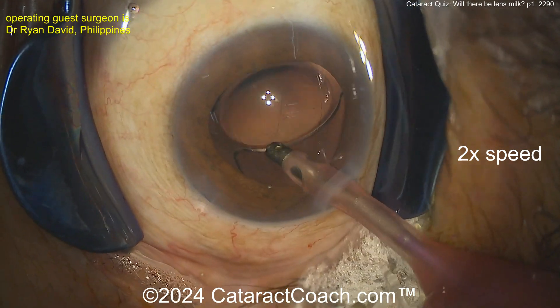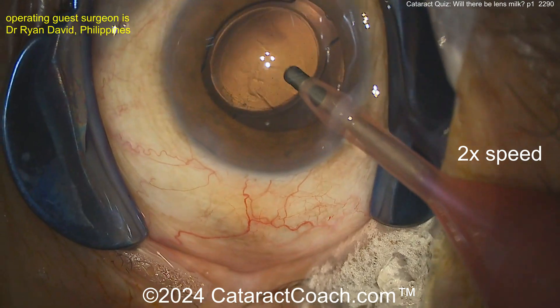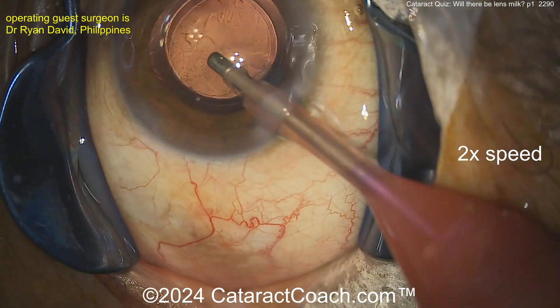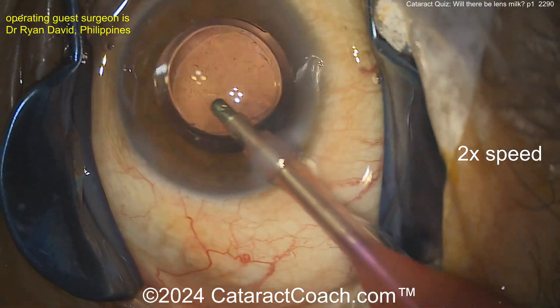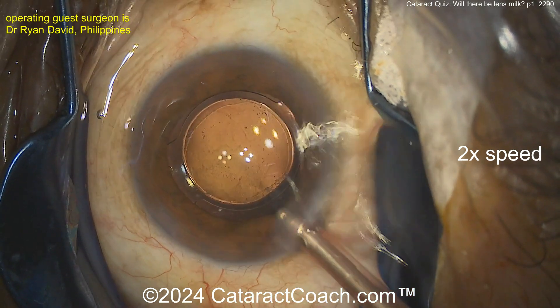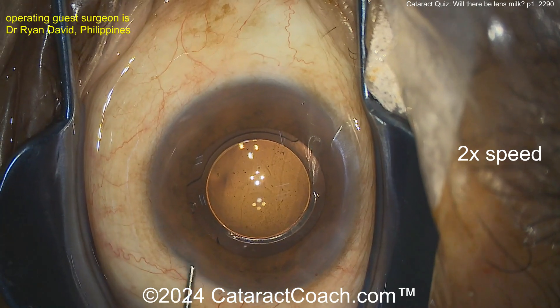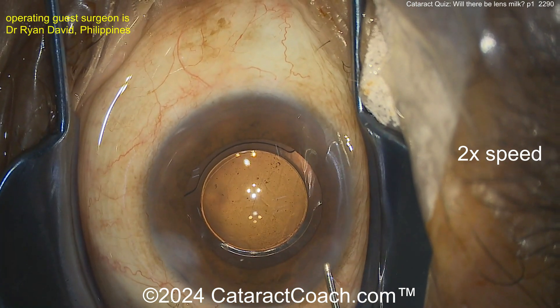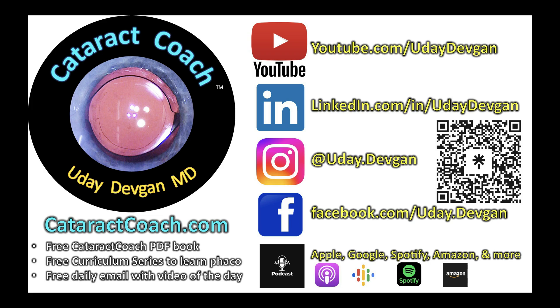The lens in the bag looks pretty good - there's the rhexis, a very nice case. So how can you tell? My clues were: it didn't have those water clefts in it, it didn't look very pressurized, and I would have touched the lens capsule with the cannula to see if it was pressurized. You can always be cautious and do a double-rhexis technique - better safe than sorry. Sealing up the incisions. Remember CataractCoach.com - free cataract coaching book, free curriculum. I do all of this truly just for you.